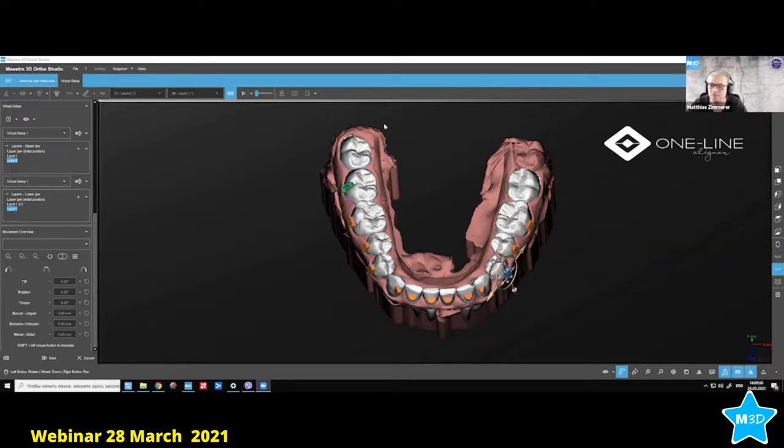So what is the maximum velocity per layer? What kind of movements can we do per layer? I'm going to post for you the movement which I do per layer, and then I can explain, or do you want me to talk about this right now? Per layer, we do movements which have to be in one direction. You change a layer because you want to change the direction of the movement. It's very simple. You cannot do distal and mesial rotation or tipping together. When you do distal, you have to do distal tipping. You cannot do mesial tipping and distal together. It's not going to work. That is what you have to see. That's why you need different layers.